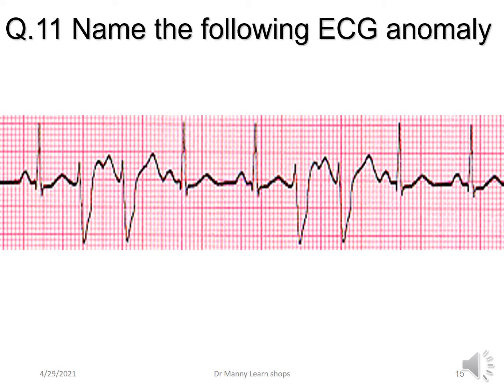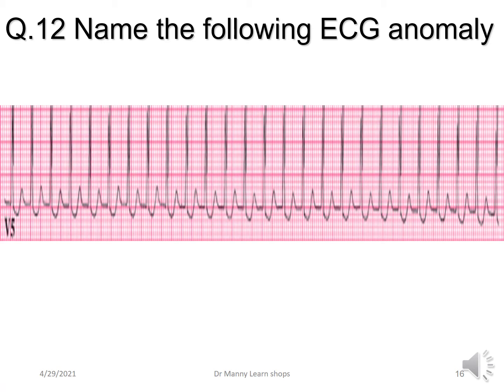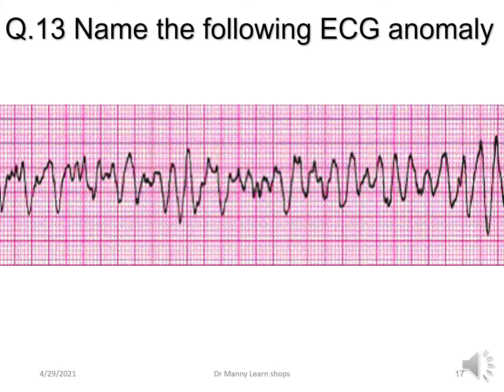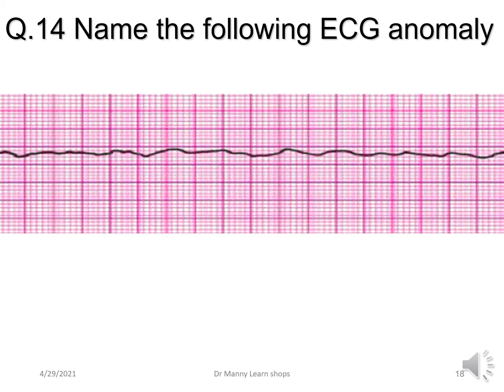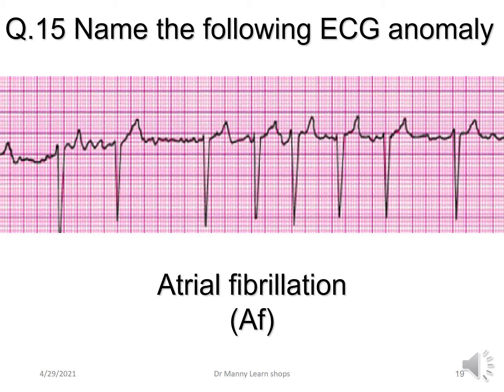Let's see whether you remember now. Name the following ECG anomaly — premature ventricular complexes, and these are couplets. What about this anomaly? There's a supraventricular tachycardia. How about that one? This is coarse ventricular fibrillation. Can you name the following ECG anomaly? This is asystole. What about this one? This is atrial fibrillation with a controlled ventricular response.